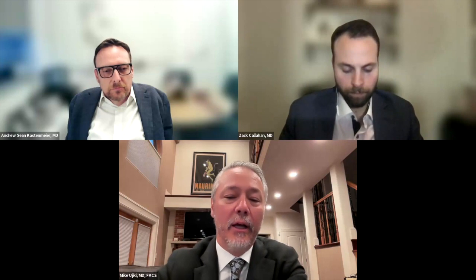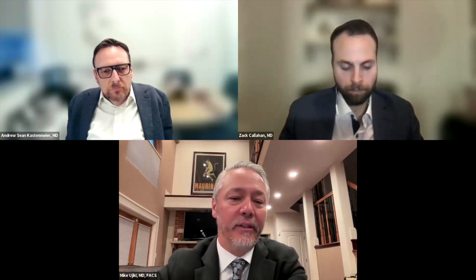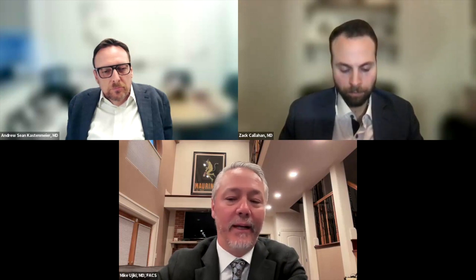I think when you bill for it, you do have to have documentation of at least some of the numbers. I've been told by our billers that if I just bill for it without any documentation, and even if I document in the note that I used it, if I don't have the actual distensibility index, or the DMIN, or a cross-sectional area, you don't get reimbursed. So you do get reimbursed. 91040 is a CPT code, but you do have to document your findings.